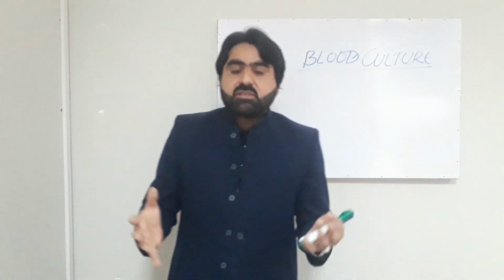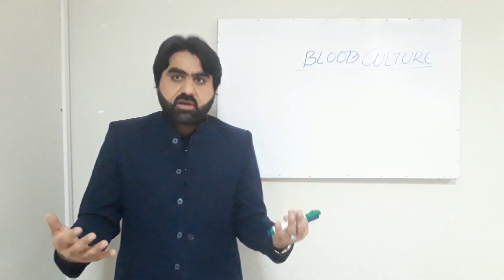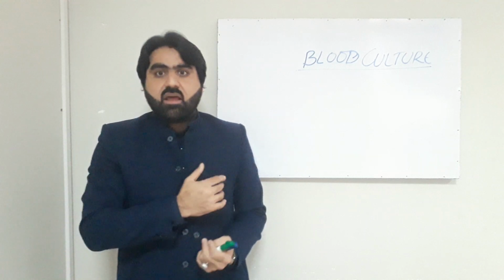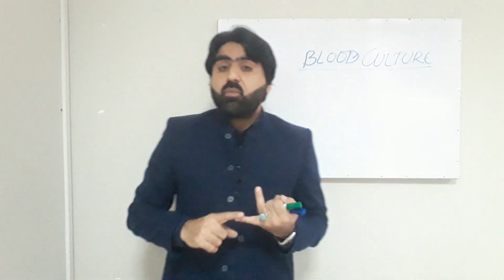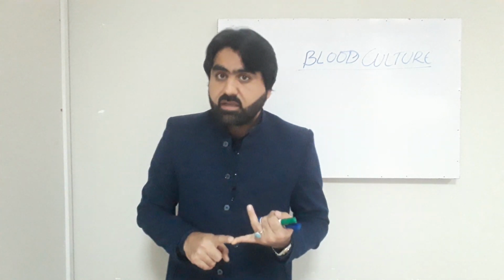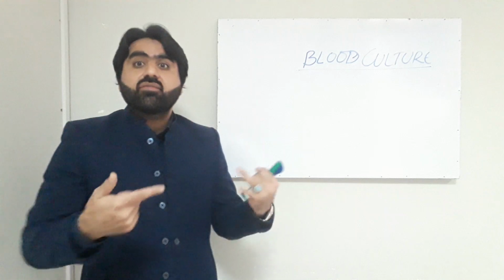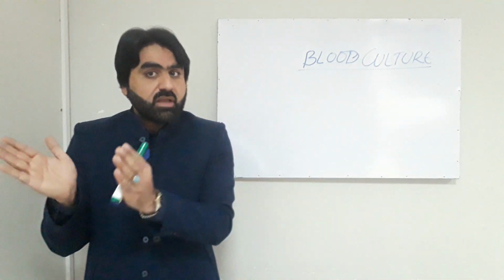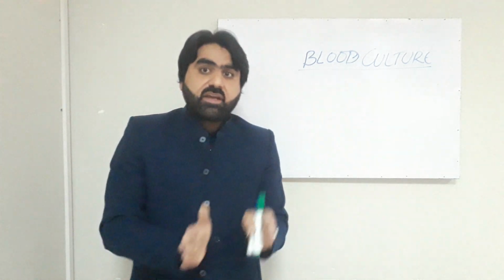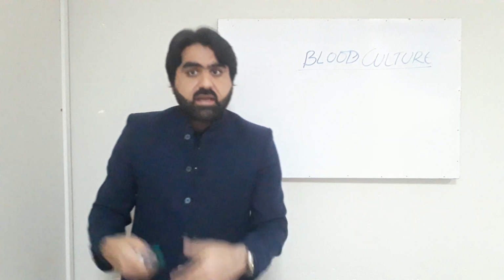There are some common questions which arise in the mind of a laboratory person about the blood culture. First, we will discuss those questions. For example, what is the importance of blood culture? The first importance of blood culture is to rule out the infectious etiology of the illness, that is, whether this particular illness is due to any infectious agent, or whether there is any other cause of that illness.